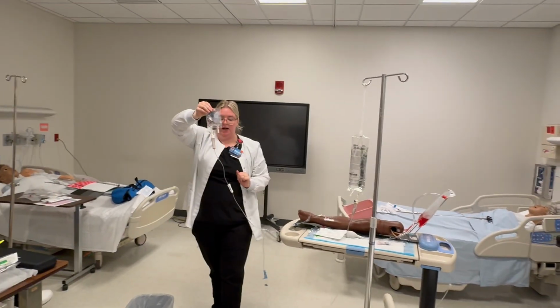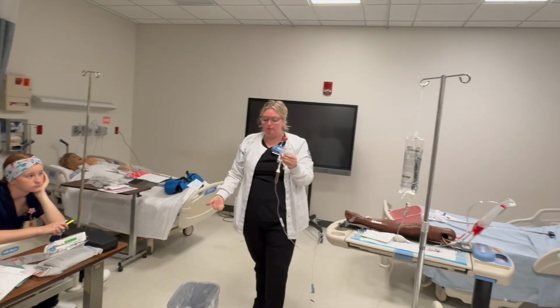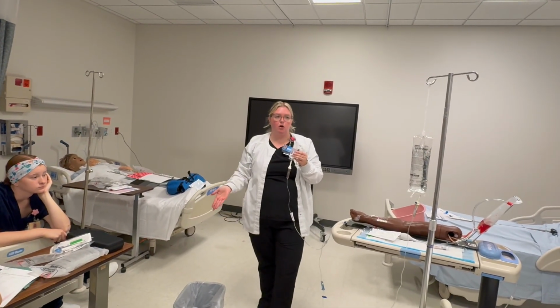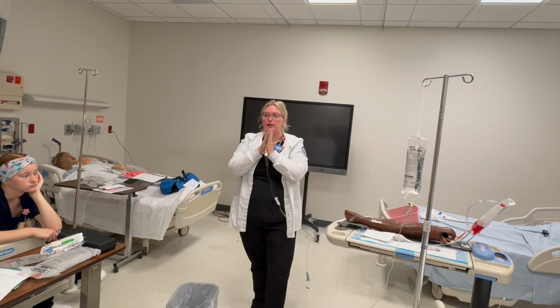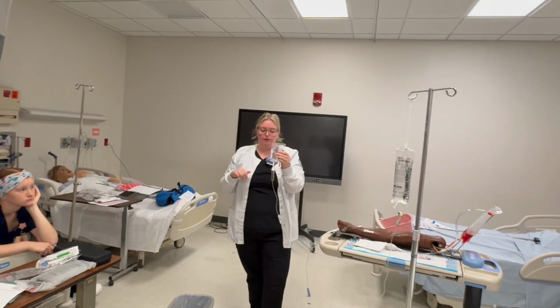This has air in it, right? I didn't prime it with medication. I don't like to prime it with medication because you saw when I primed the primary how much medication came out, even though it was intentional. My patient needs all of this medication to fight their sepsis infection. So you don't prime with the solution.